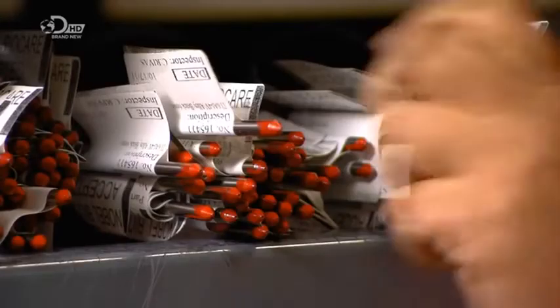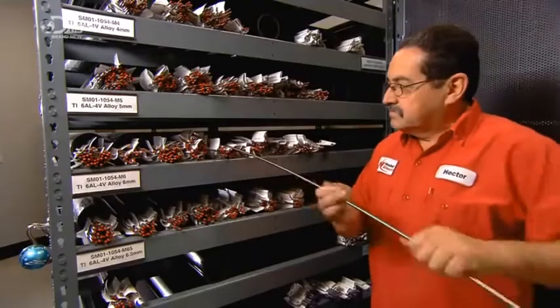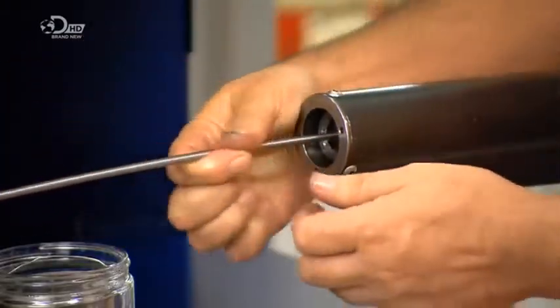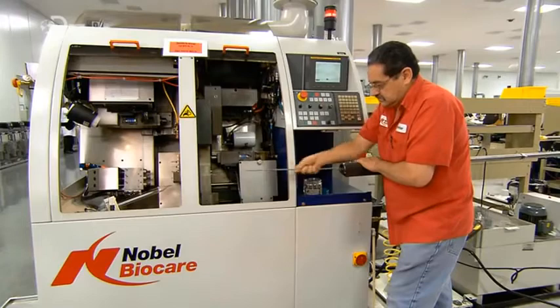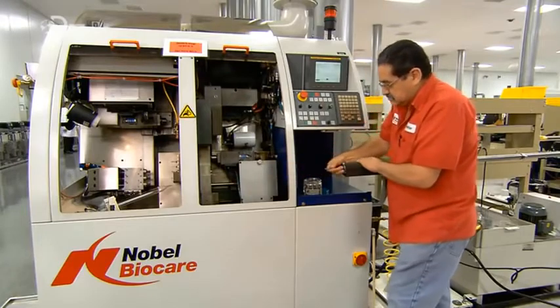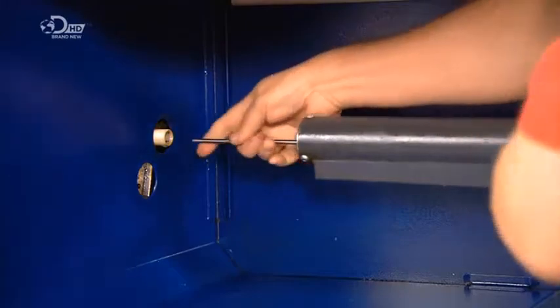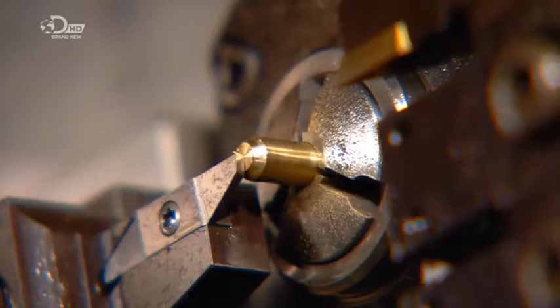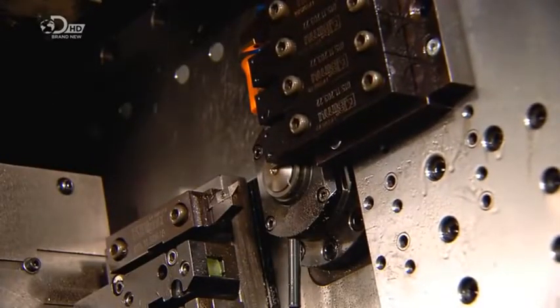To make these implants, they start with a solid titanium rod. This 4-meter rod will be used to make more than 200 implants. The technician inserts the rod in a long holding device, which keeps it straight as it feeds it into a lathe system.